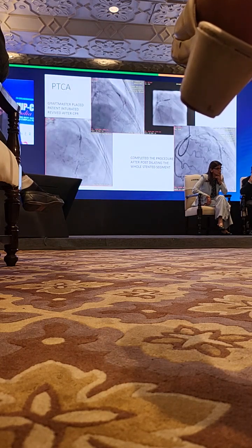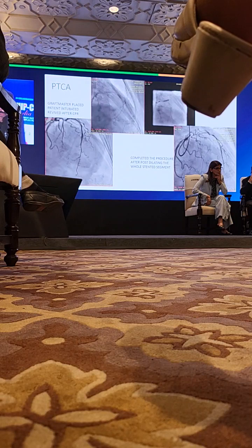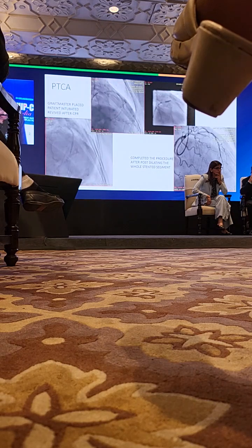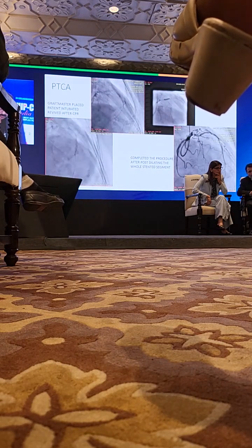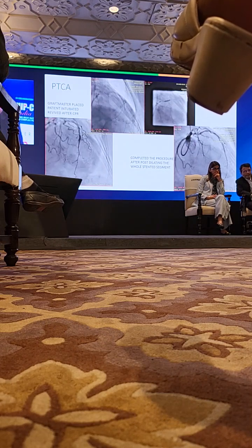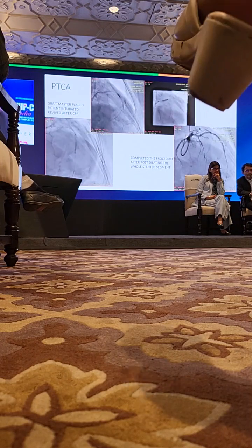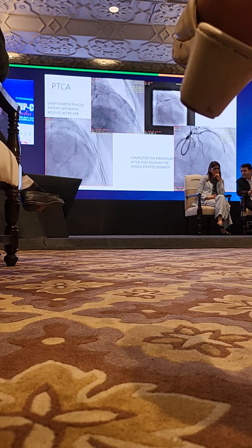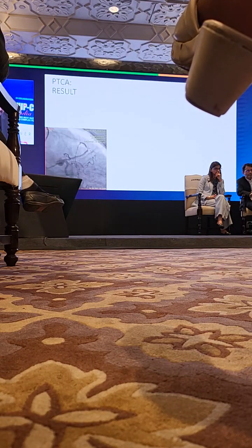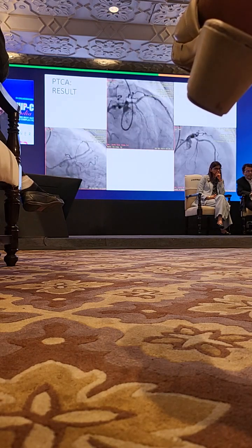Now in the last angio, which I was able to see later on, but I would like to show you here, in the extreme right of the slide, just after the guide catheter, you can see that there is some indentation there, which initially I thought might be something, so I took different angles, but in other angles that particular indentation was not seen.